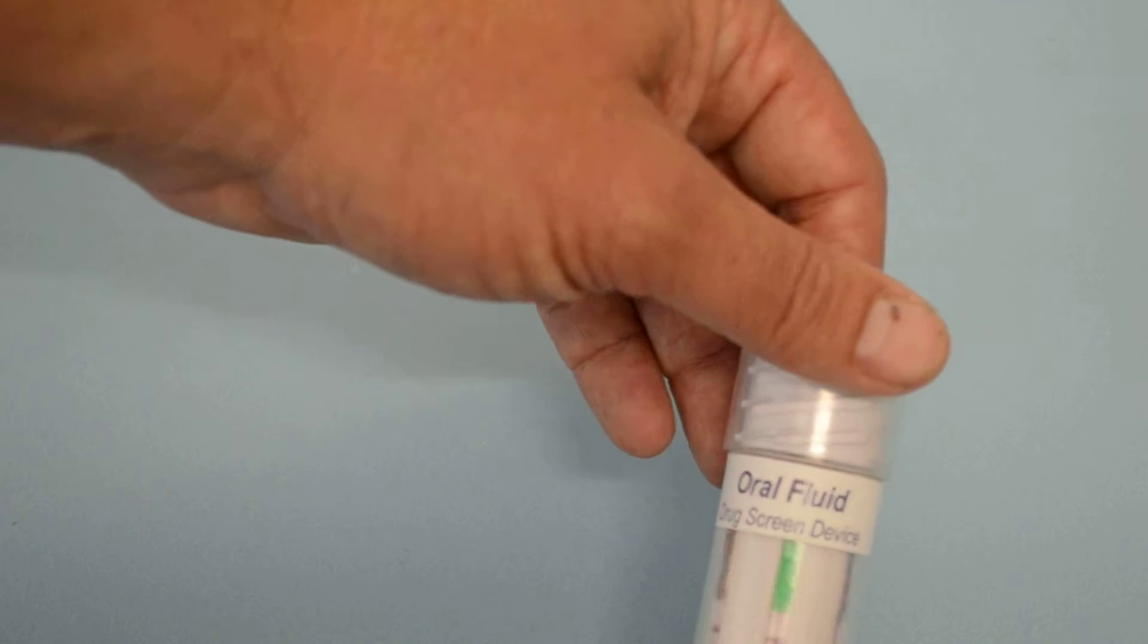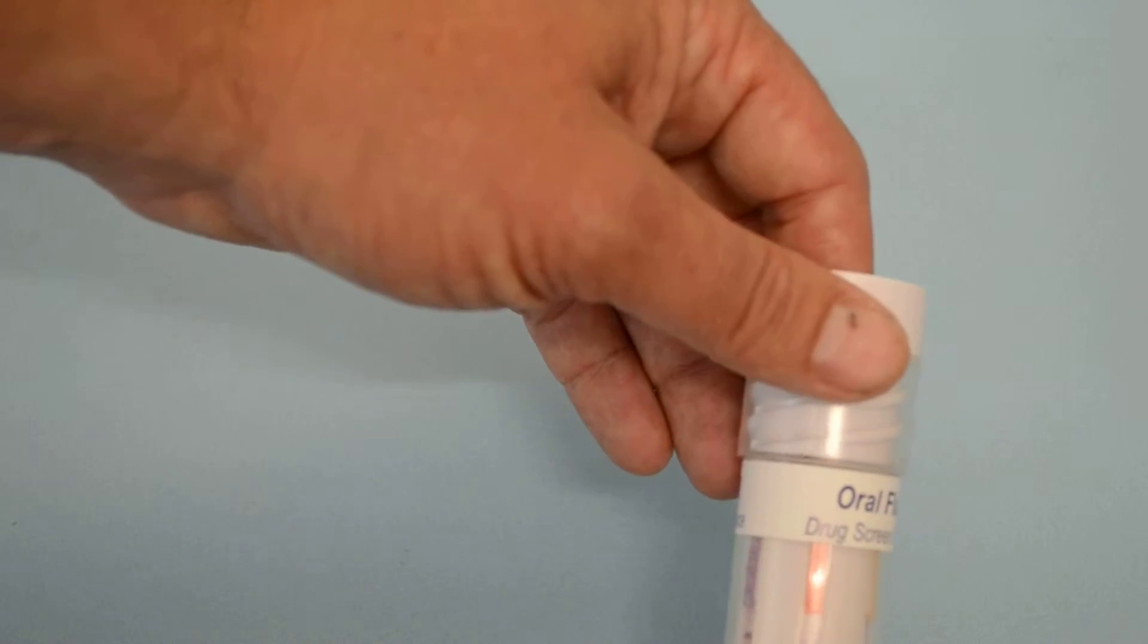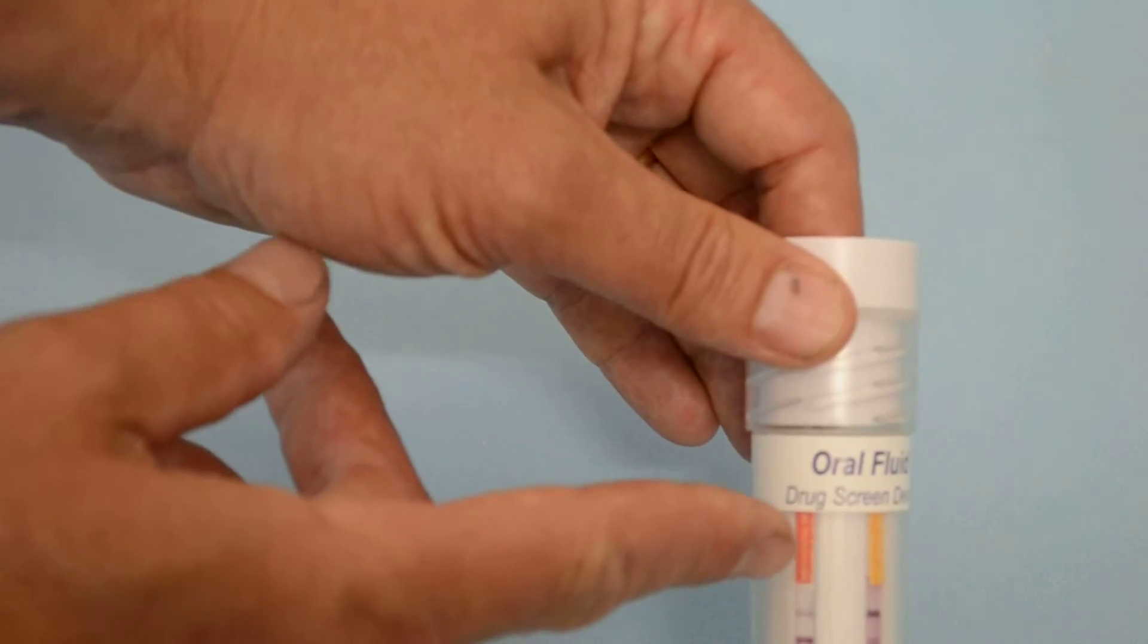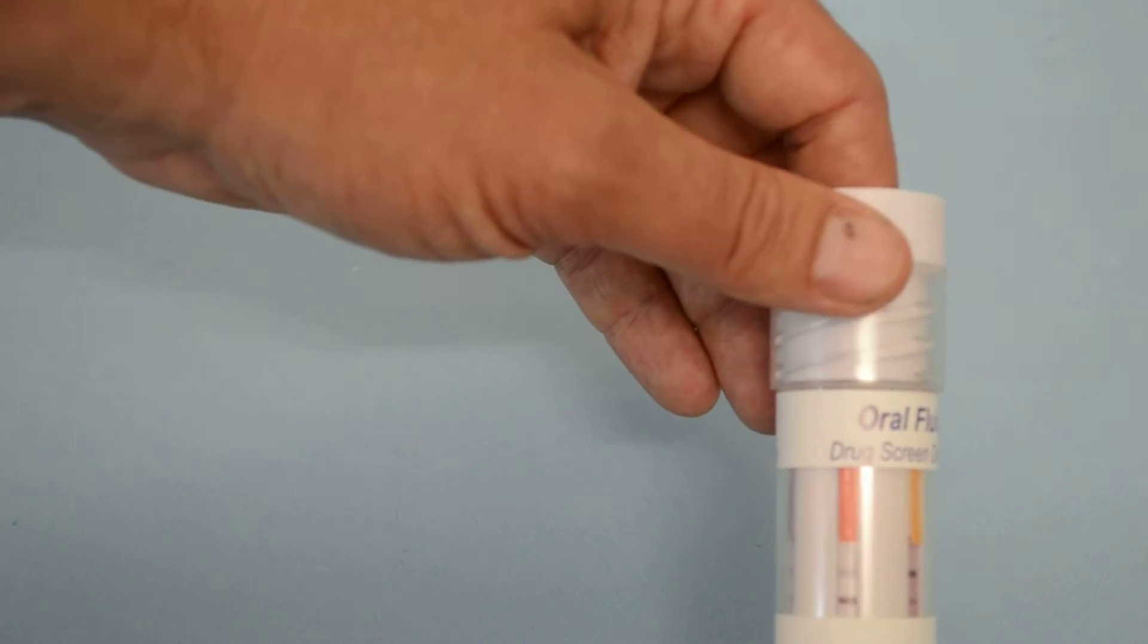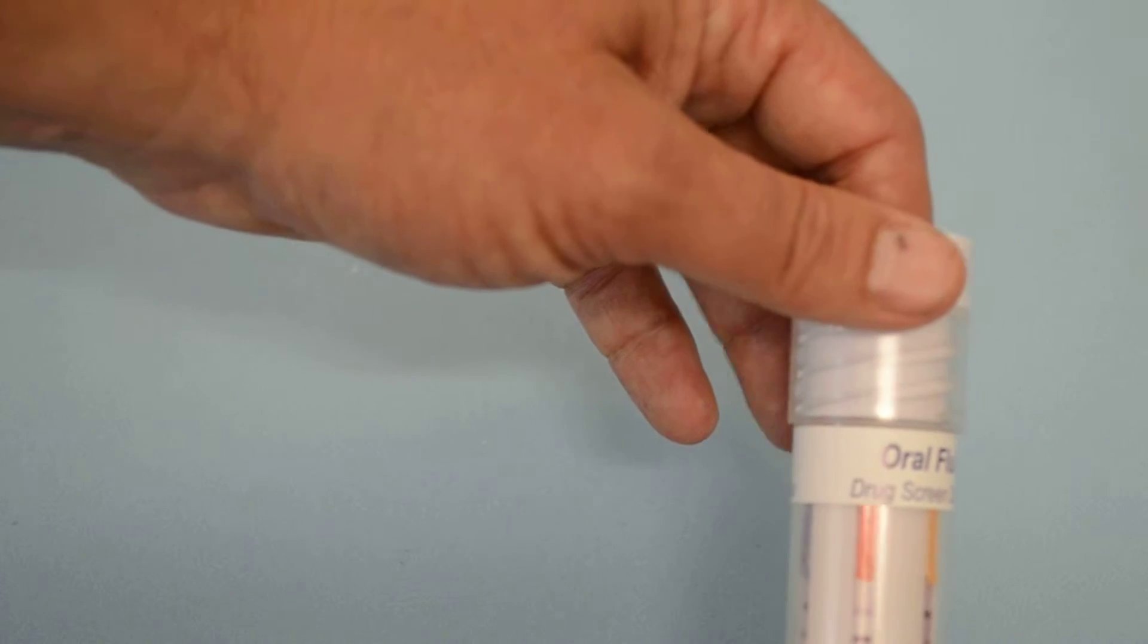What you can see here is some really nice clear control lines. The control line is the line that forms nearest the handle end, furthest away from where the sample has been added and shows that sufficient sample has been added and absorbed by that test membrane.